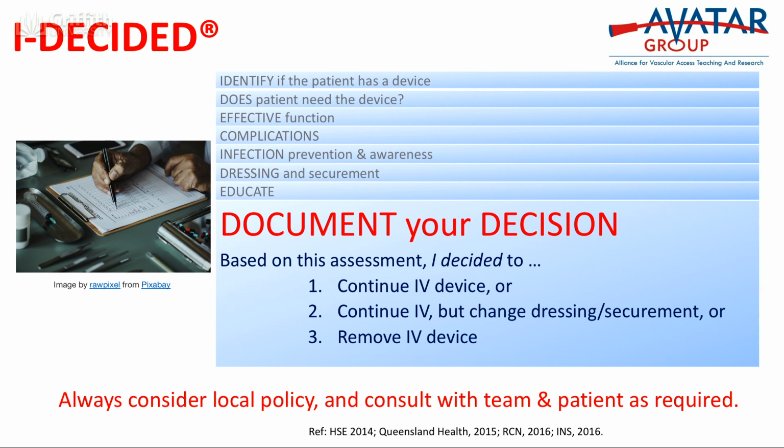And the final D stands for document your decision. So based on this assessment, I decided to continue the IV but change the dressing or securement, or remove the IV. Now, obviously, you would always consider your local policy and consult with the team or the patient as required at your hospital. But documenting the IV and documenting a decision based on assessment is crucial.